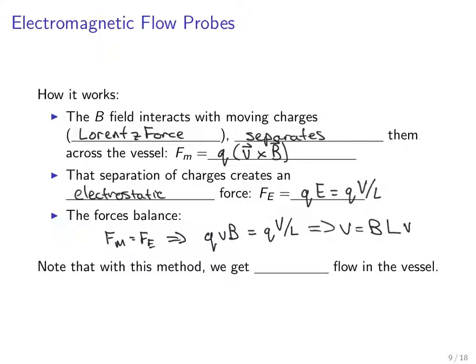So the velocity here is little v, and the voltage that we measure is capital V.